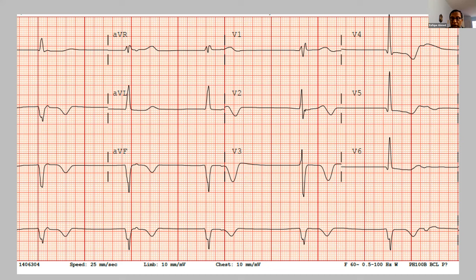Yeah. So you're right, because first of all, the variability can be described. You can have retrograde P waves. But what Tushar made a point of is that the P wave in lead two is positive. So probably there is marked sinus bradycardia with junctional escape.